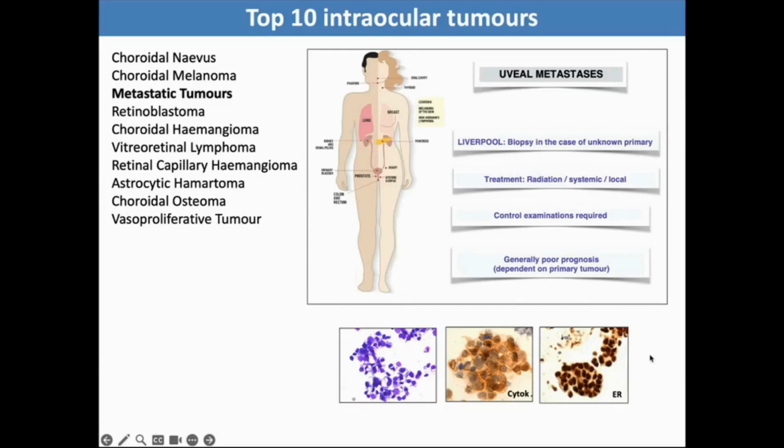a female, then we would typically perform estrogen and progesterone staining, reserving some of the sample to potentially perform a cell block and do the HER2 staining. We also would do the TTF1 to demonstrate it being a lung carcinoma in the case of a known primary in the lung, or if there's a suspicion of prostate cancer, then we would also perform the markers for prostate carcinoma.